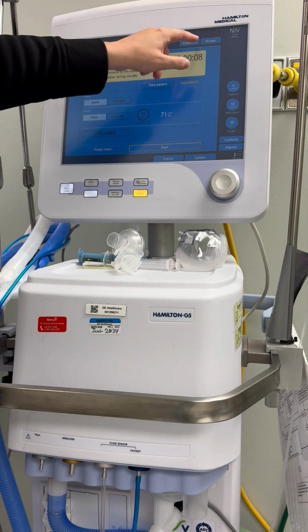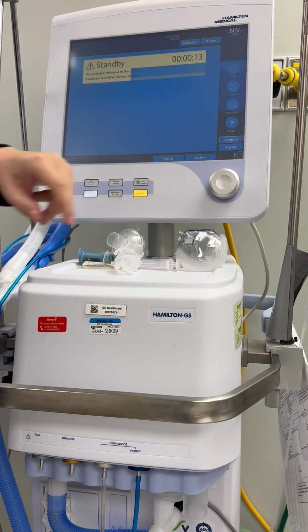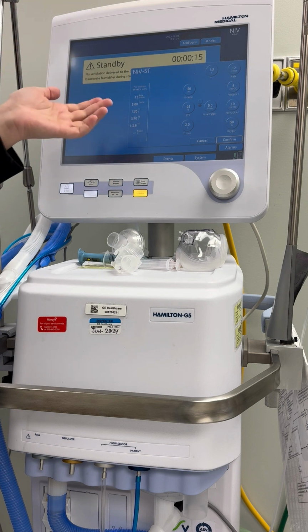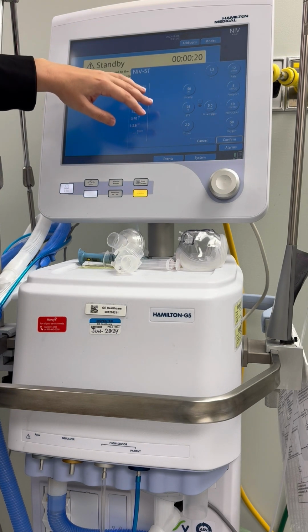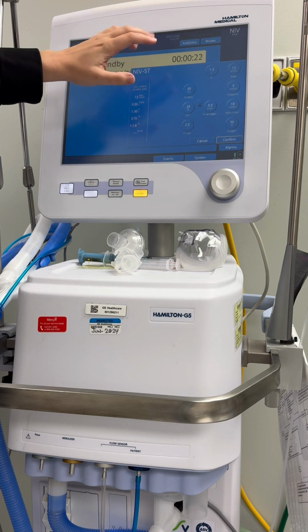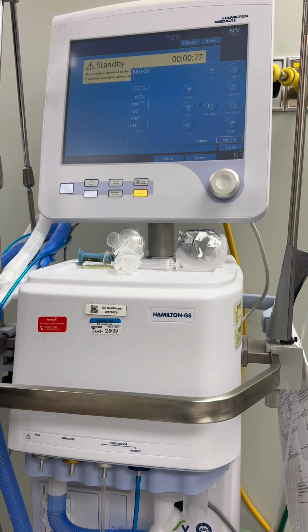So we'll go back to modes and select the NIV ST. Continue. Now a little bit different screen here. So you notice you do not have a backup ventilation mode. Instead, your patient has a backup respiratory rate. So that respiratory rate right now is set to 12, still 5 of pressure support, 10 of PEEP or CPAP, and then 50% FiO2. You still have your flow trigger, you have an inspiratory time, and you have your expiratory sensitivity, your I time max, and your ramp.